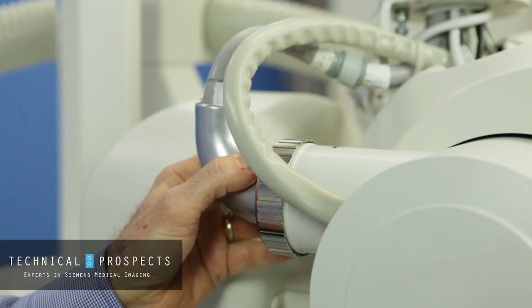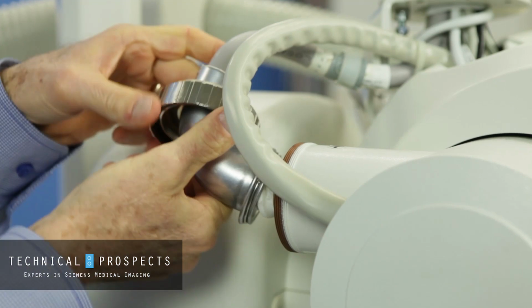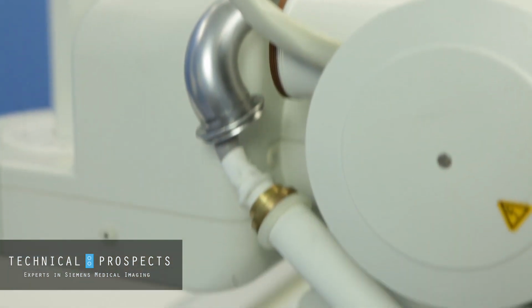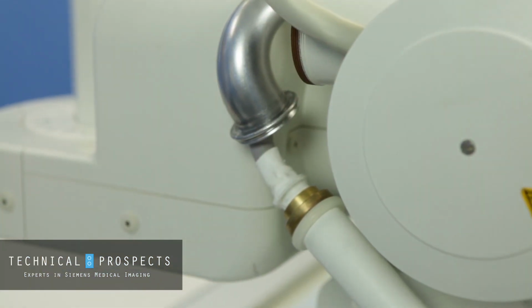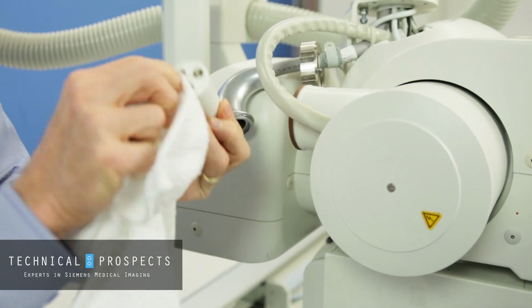First thing you're going to do is loosen the set screws. Then remove the candlestick and voila. Usually, this is what happens. It falls off. What you're going to want to do is make sure everything's good and clean.